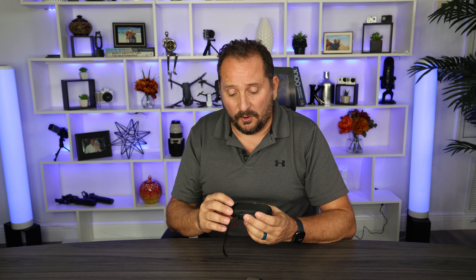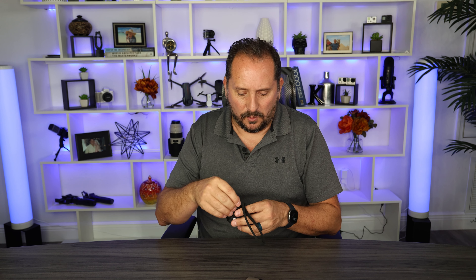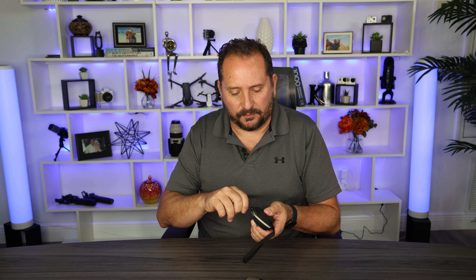I just got it myself and I'm playing with it for the first time. It comes with a handle. The handle is nice, solid, looks like it's well attached. So you don't have to worry about it.